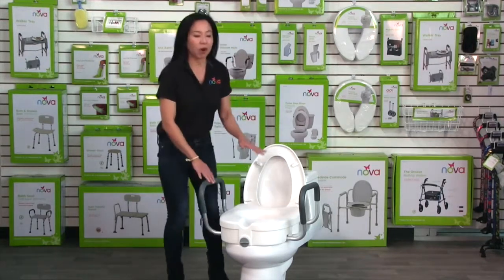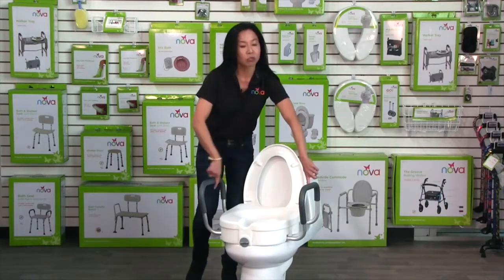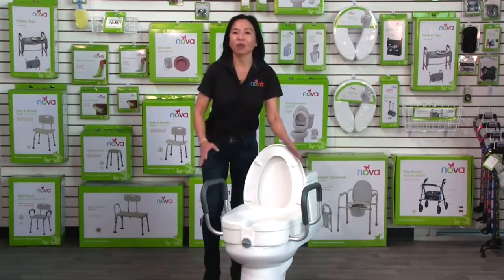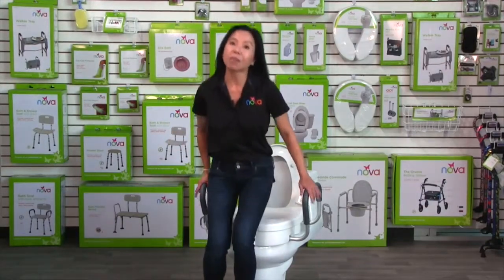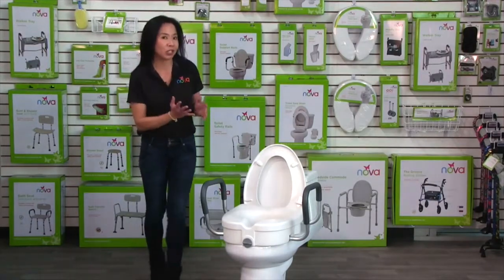I love this raised toilet seat with arms because it has a wider clearance. It has two adjustments and goes up to 20 inches, giving you a lot more room between the handles. It raises the toilet seat five inches and the arms give you a lot of support, making getting on and off the toilet so much easier and safer.